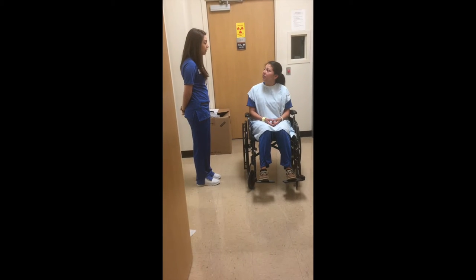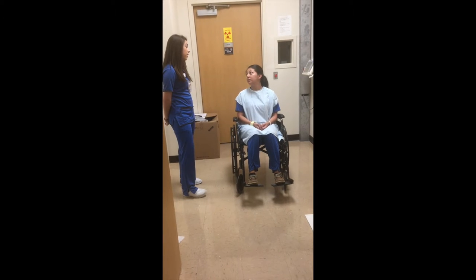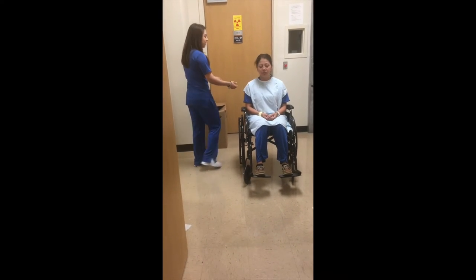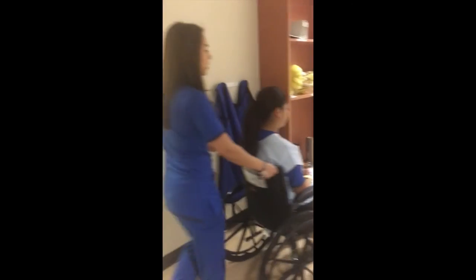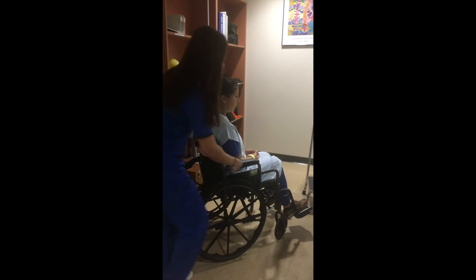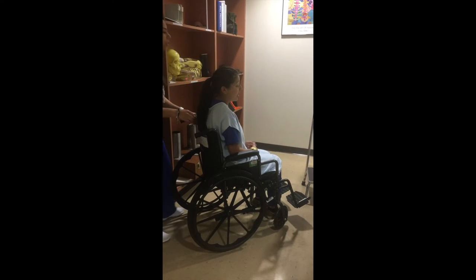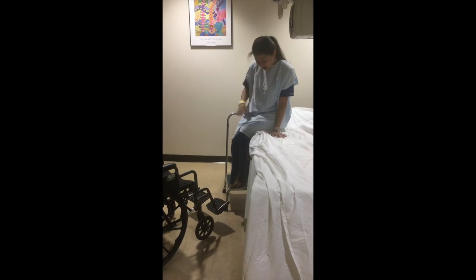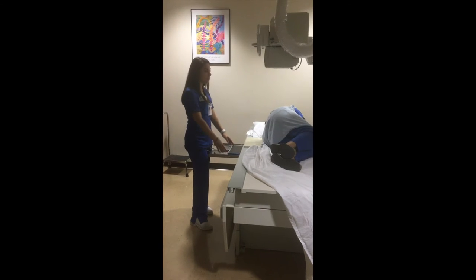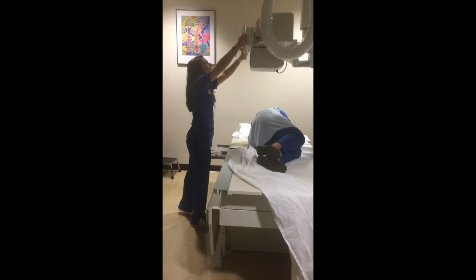What's your name? Brandi Garza. Date of birth? 4-4-95. Can I take a look at your wristband? Thank you. What brought you in today? I fell — I was at the mall, I was looking at a window display, I wasn't paying attention and I just fell. We're going to be taking an x-ray of your lumbar spine, your lower back. My name is Morgan, by the way. Let me lock this for you, we're going to get you onto the table. Make sure you don't hit your head. For this projection, you want to make sure that you have a 10 by 12 IR inside the Bucky and a 5 to 8 degree caudal angle.